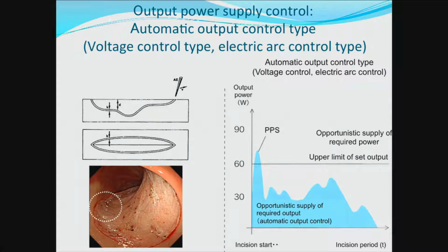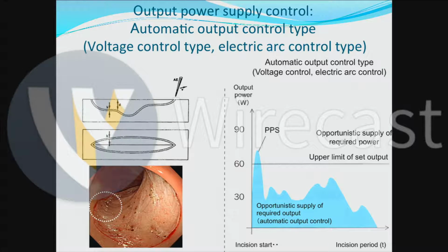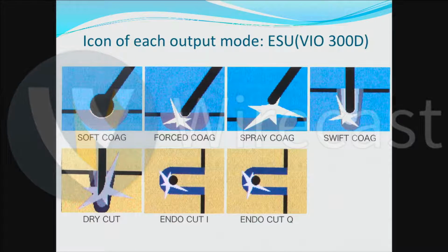In brief, constantly maintained voltage keeps the coagulation depth at the incision edge, as well as enables the best cutting quality at the incision. This voltage control produces appropriate coagulation depth in different situations by supply of enough required power. That is, voltage control enables excellent reproducibility of coagulation depth in every situation: incision, dissection, and hemostasis.